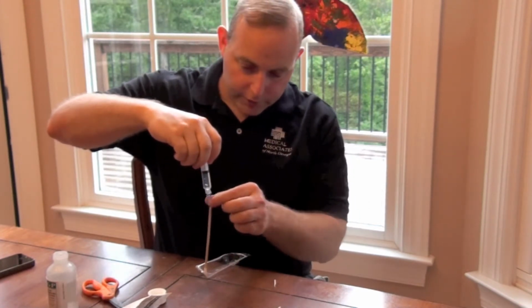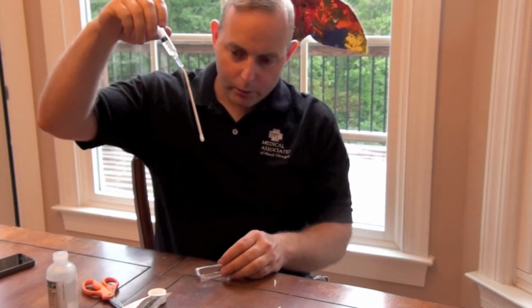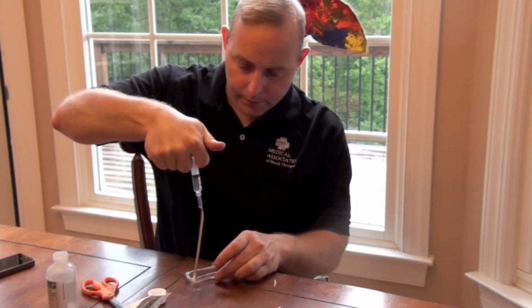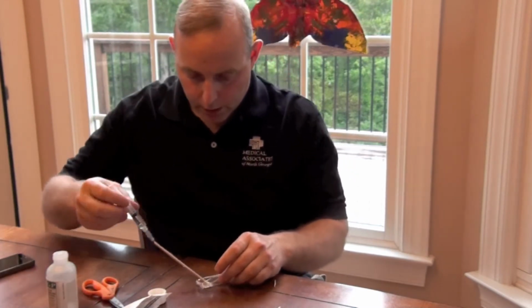An older version of this technique was lidocaine just dipped onto the cotton tip applicator, and you would get only that much. No way enough to get a therapeutic dose of between 2 and 4 ccs. There we go. I have a nice amount on the end. What I would recommend is, if you're doing this with patients, just wear a pair of gloves.